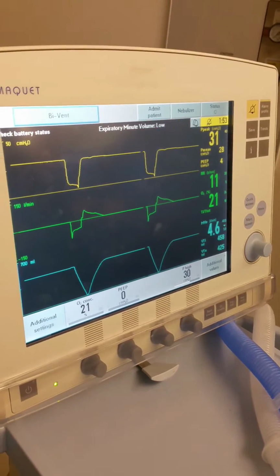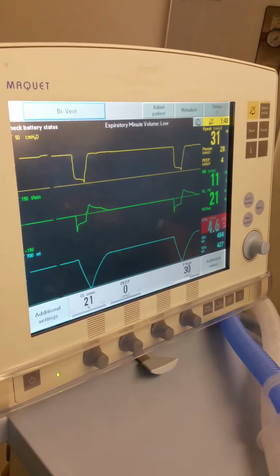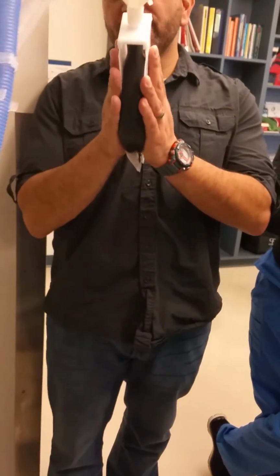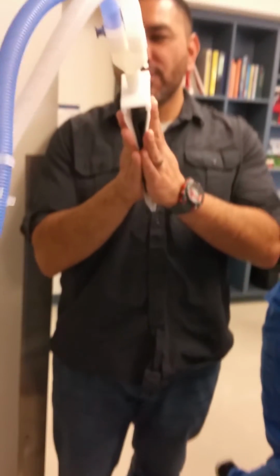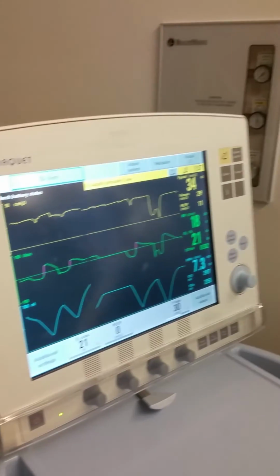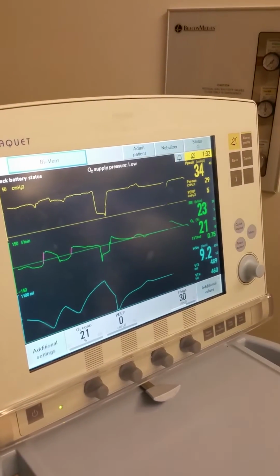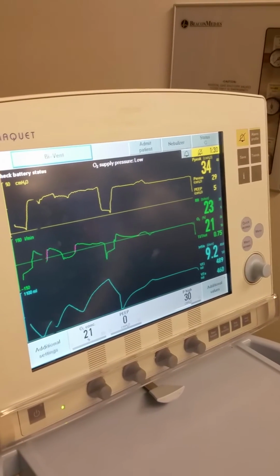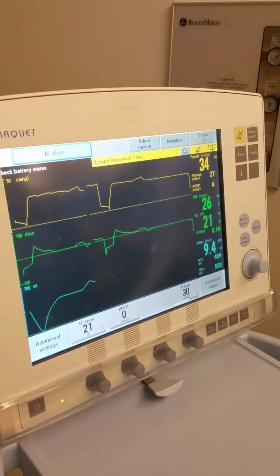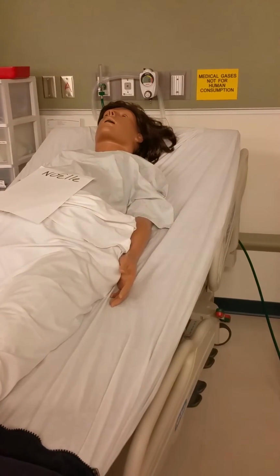Yeah, so usually if we can't create that residual PEEP, here's the mechanics of it. If my lungs were so stiff and they recoil really fast on expiration, and no matter what I do, I'm releasing more than 30 to 40%, I might have to set a little bit of PEEP. So it won't matter if I set a PEEP of 3 unless it comes to that. It's essentially a backup PEEP.